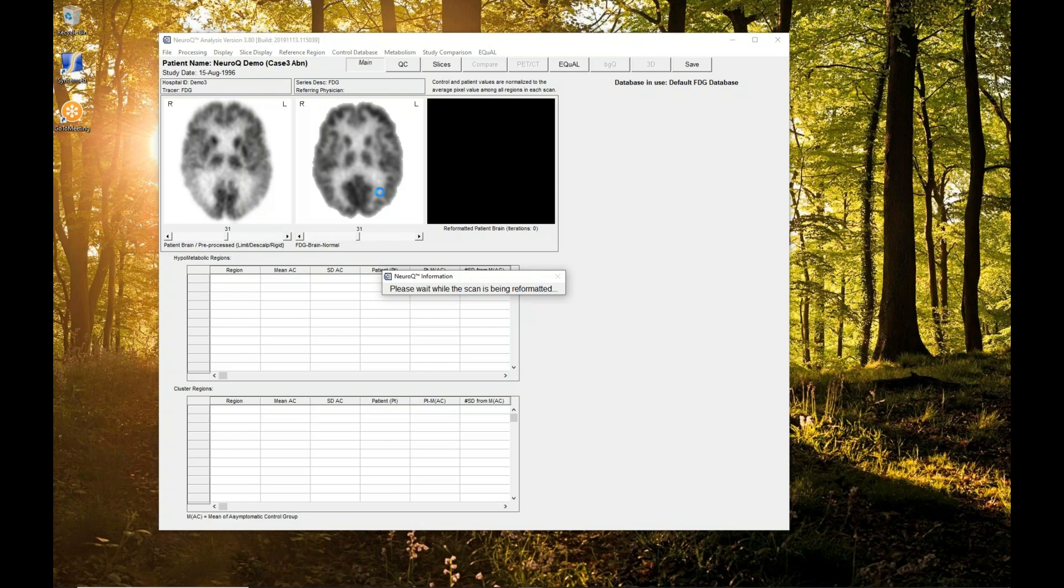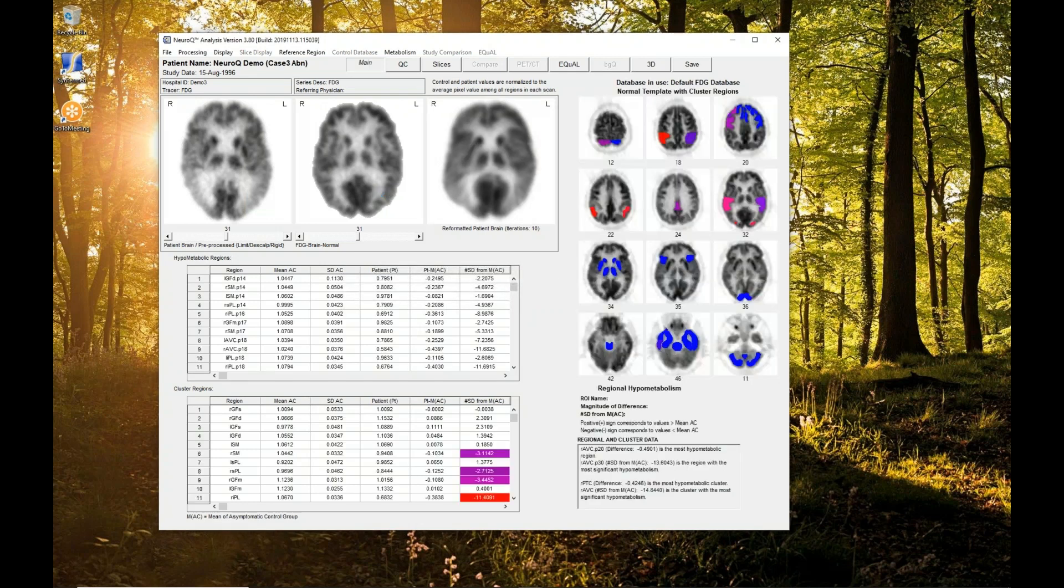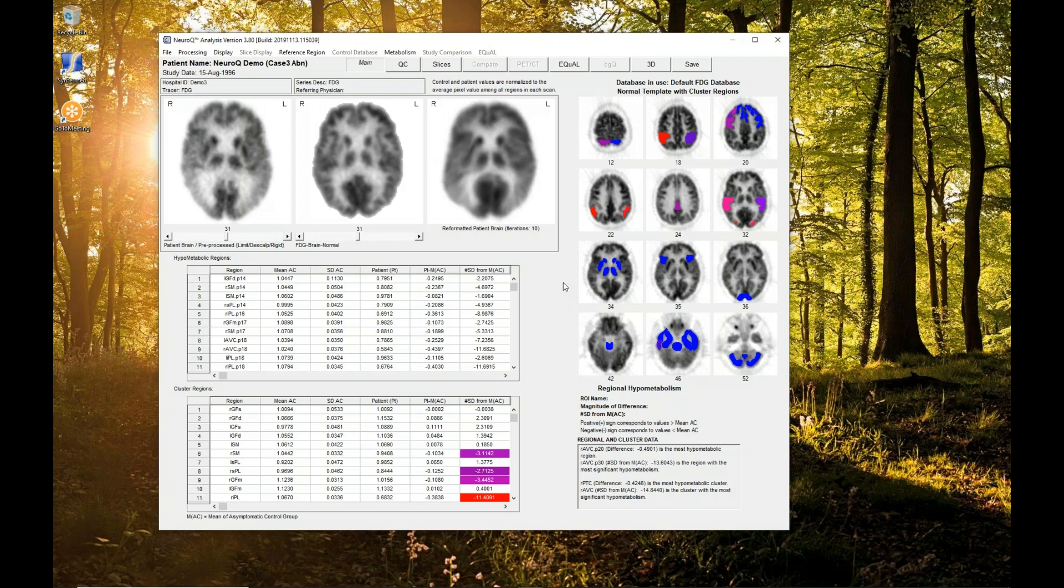We'll wait for this to complete. There we go. Once it's completed, one can save the study. It saves all of the processing and reorientation and reformatting so that the referring physician doesn't have to go through the process that I just went through.